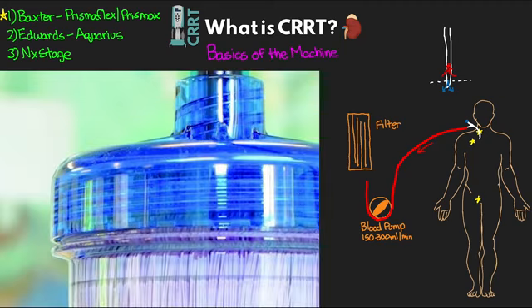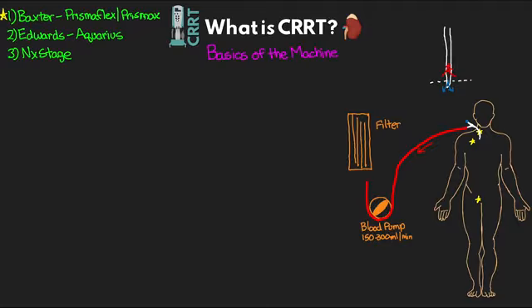And I'm going to put up a picture here to hopefully show you kind of what that actually looks like. And if you really look at it up close, it really looks like thousands of tiny hairs. And so what we get is the blood flows up from the bottom to top inside of those tiny fibers. And it's here in this filter where all the magic is going to be taking place.